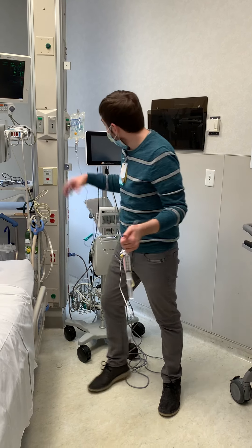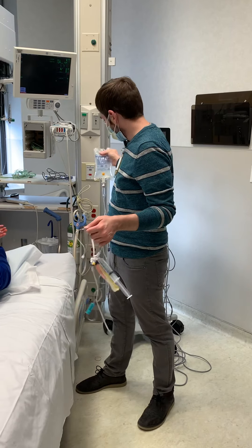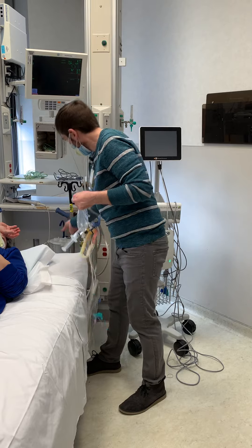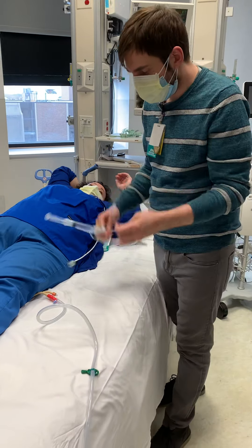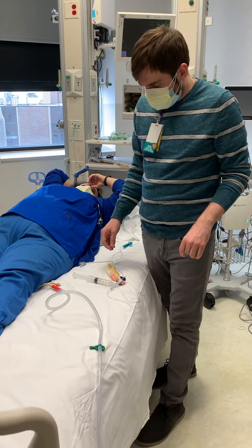This is how we set up our intra-abdominal bladder pressure. We want to do an intra-abdominal pressure for a patient who we think may have intra-abdominal hypertension or abdominal compartment syndrome.